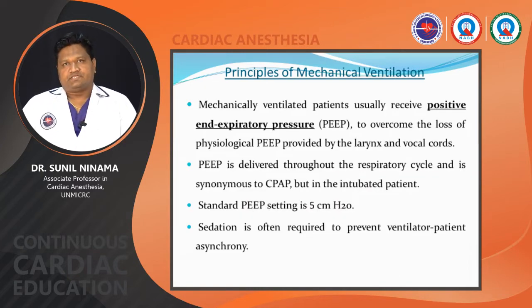A mechanically ventilated patient usually receives positive end-expiratory pressure to overcome the loss of physiological PEEP provided by the larynx and vocal cords. That's why the patient requires a minimum PEEP of at least 5. PEEP is delivered throughout the respiratory cycle and is synonymous with CPAP. Standard PEEP setting is around 5 cm of H2O, and sedation is often required to prevent ventilator-patient asynchrony.